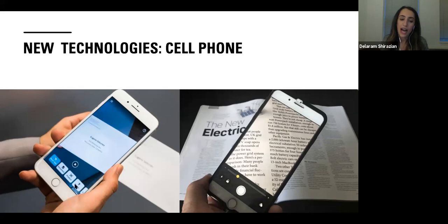The other application that I often recommend is an app that's free on iOS called Seeing AI, and that stands for Artificial Intelligence. So this utilizes artificial intelligence in order to do a lot of things. The first thing it does is it can actually read text out loud to you. So if you simply take a picture of a piece of paper, it will read it out loud to you. So if you're unable to see the print, it utilizes audio. You can also scan products with it. So if you have 2 cans of soup at the grocery store or in your pantry and you're not sure if one's chicken noodle or one's tomato, you can actually scan the barcode.